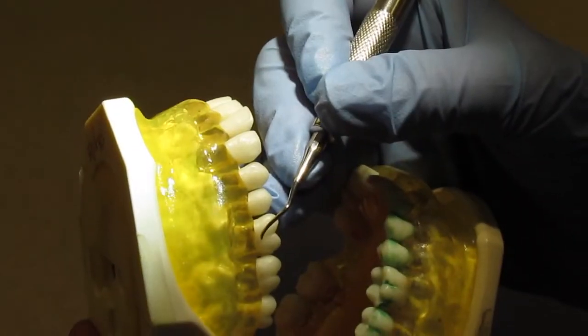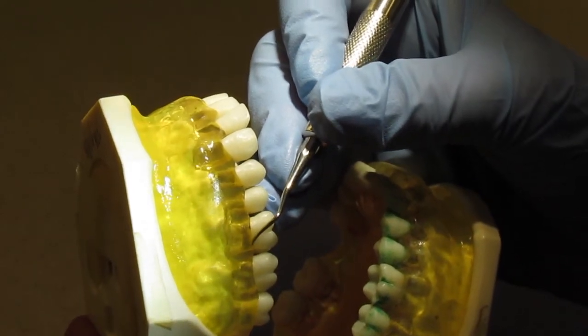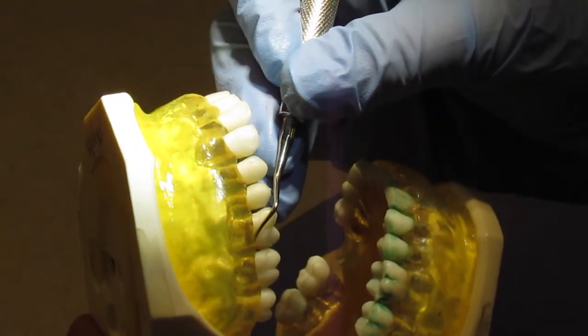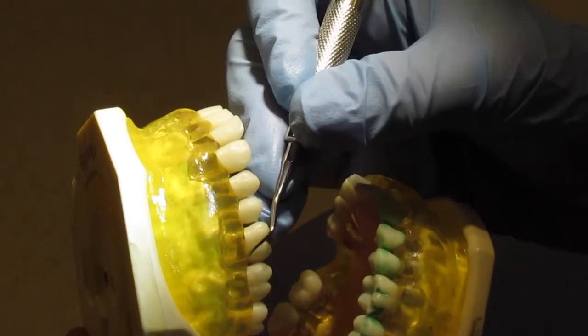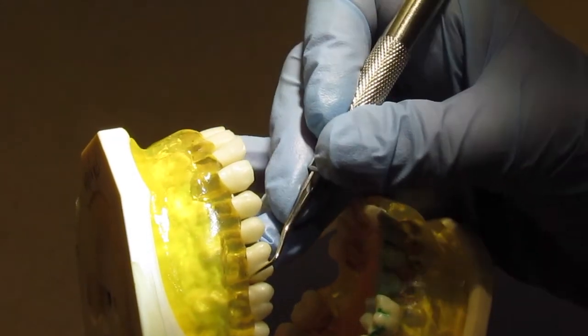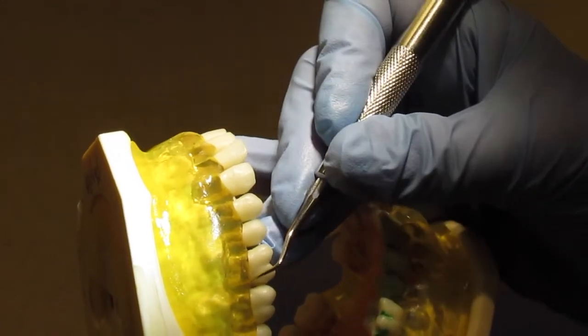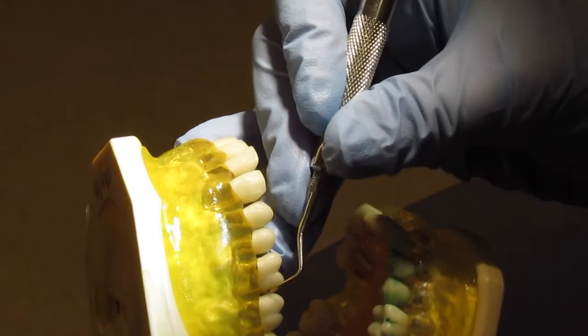Your fulcrum is going to be on the lingual occlusal. You're going to reach back with your secondary blade and be sure to raise your handle up a little so you close the blade. Initiate little up and down rocking strokes and then pivot toward yourself so that you bring the instrument into the distal interproximal area.